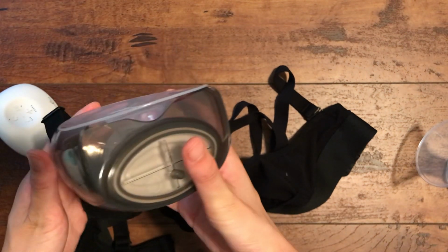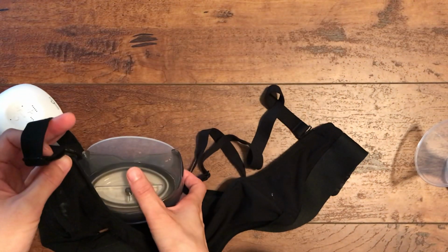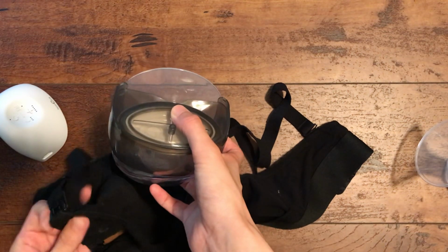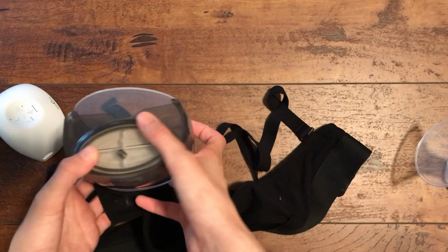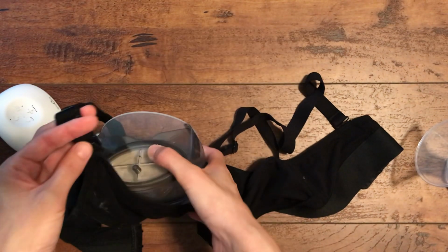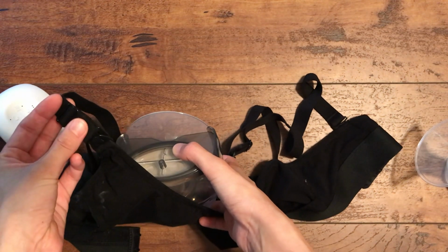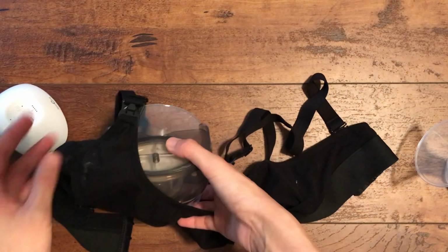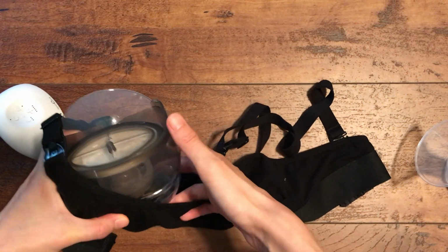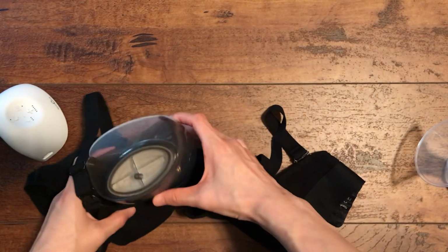I would go ahead and first wear the bra, and then place this in here, instead of placing this on your breast and then placing the bra. That might mess up the suction too. So I would wear your bra and place it in, and then adjust your straps if you need to. And if you need to check your progress, you can still do that by peeking in through the middle here, if it makes sense. So that's what I've been doing.